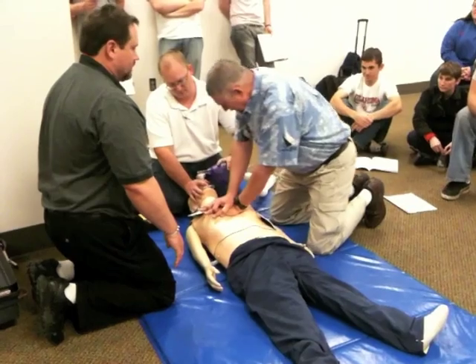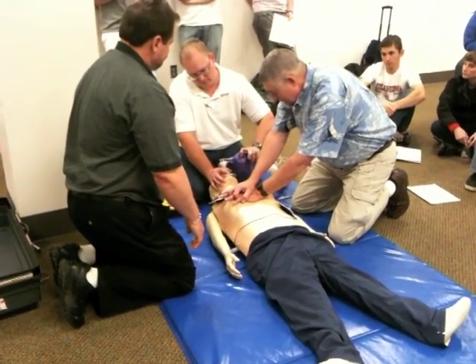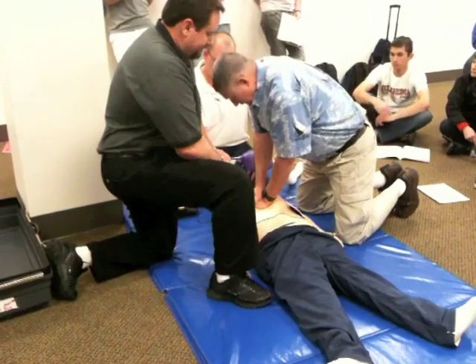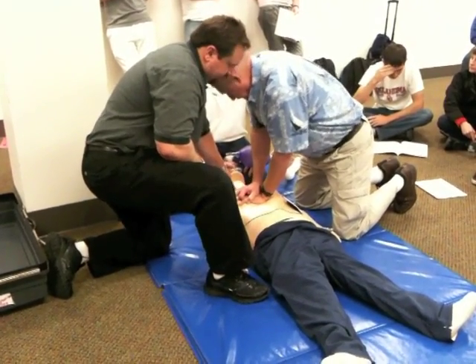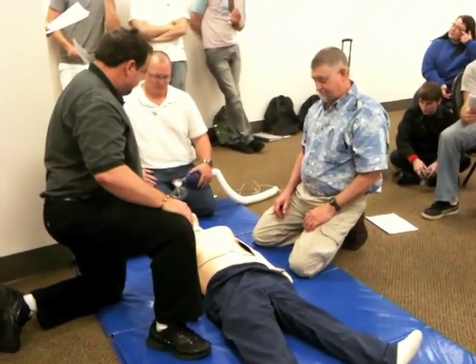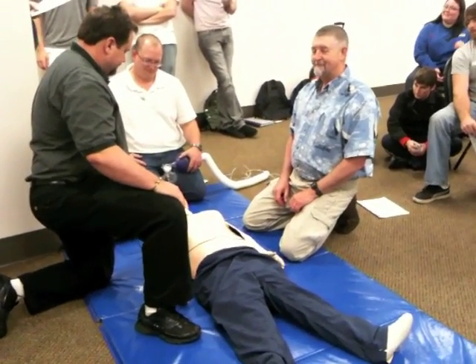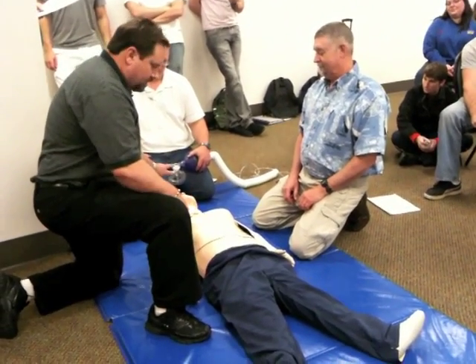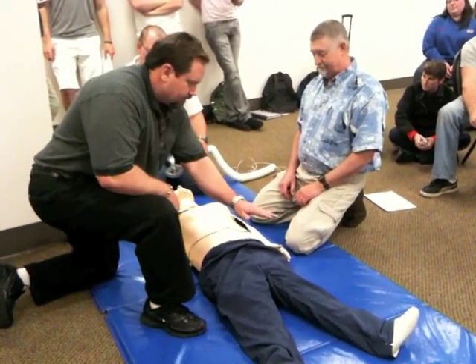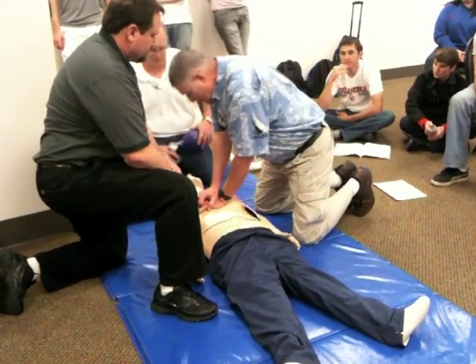28, 29, 30. We'll put him on the cot as soon as it's available. This is the longest part right here — it makes you feel like you've done something wrong. It's a long two minutes. Your compressions are still good. Let's clear the patient. Evaluating heart rhythm. Don't touch the patient, sir. Preparing to shock — it is going to shock now. Stay clear, everyone clear. Press the flashing button. I'm clear, you're clear, we're all clear — clear! Resume chest compressions. Provide chest compressions, and we'll transport.